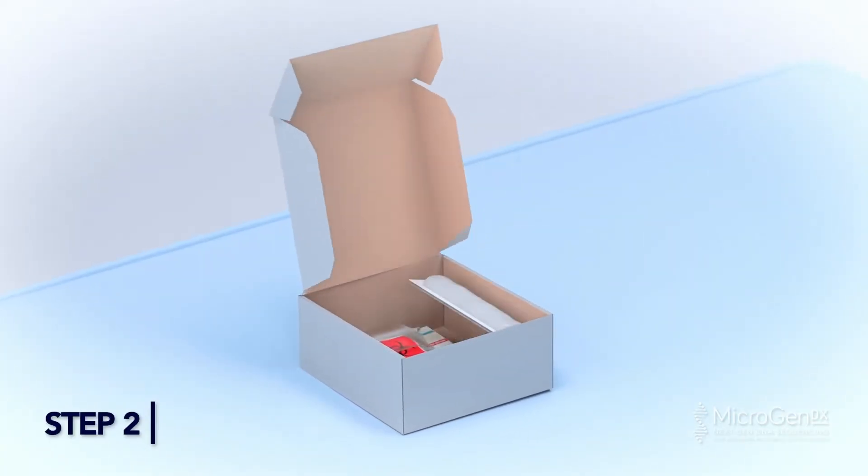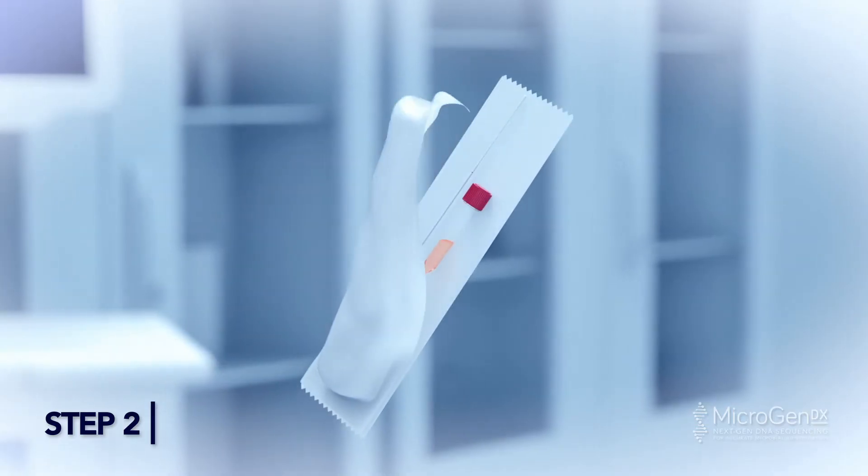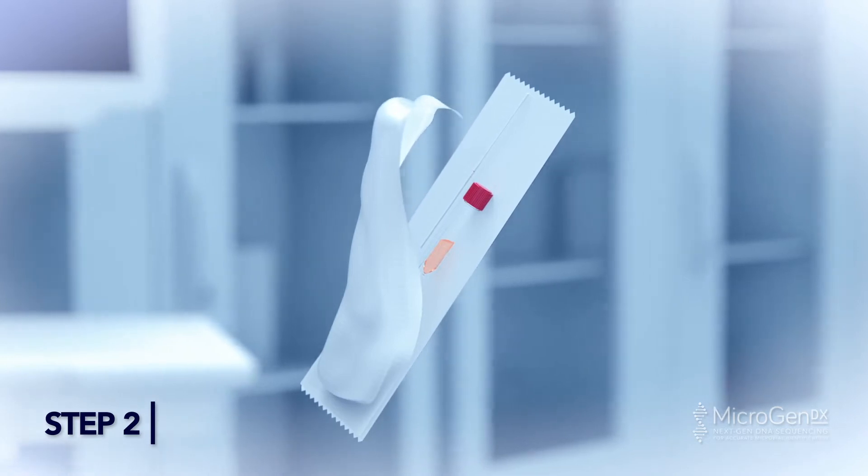Step 2. Open the Nasopharyngeal Swab Collection Kit. Carefully remove the mini tip swab from packaging. Avoid contact of the swab tip with gloves or any surface.